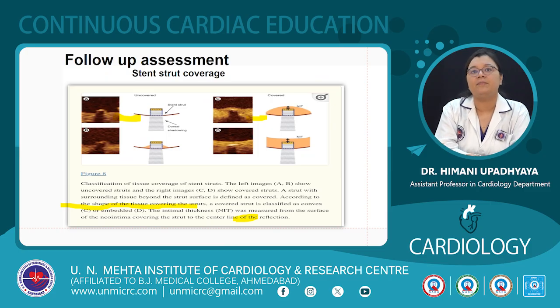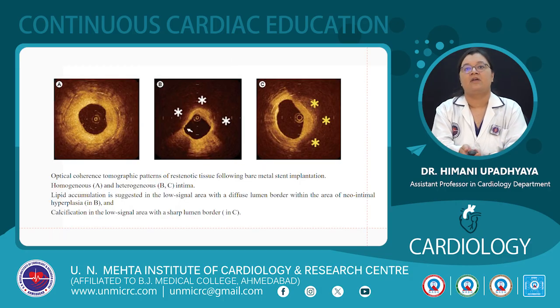So for the follow-up assessment of stent strut coverage, as seen in image A and image B, the struts are uncovered, they are not covered with neointima, but in image C and image D, the stents are covered with neointima. So there is less chance of stent thrombosis.